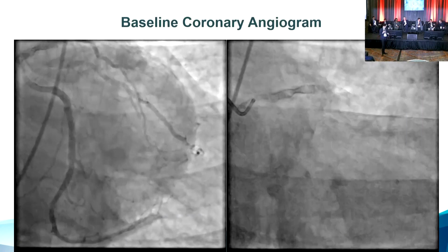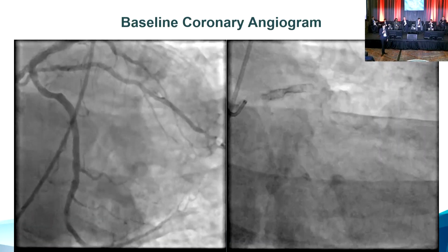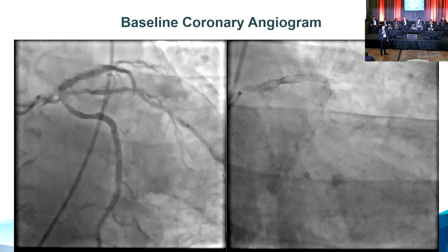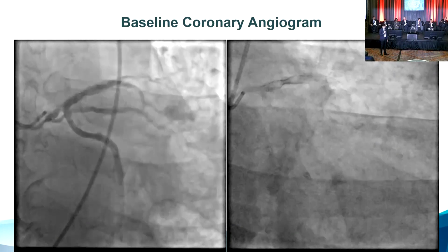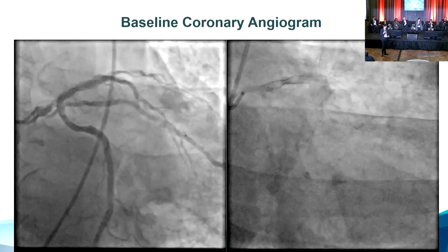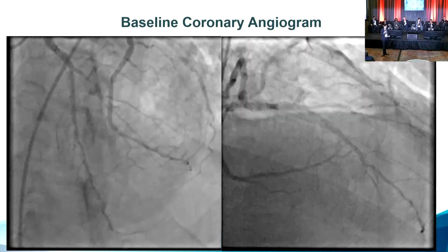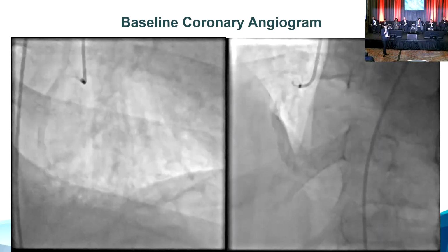You can see that he has severe left main disease and distal left main disease, possibly extending into the proximal LAD, and most remarkably, there is a stent in the LAD that is severely underexpanded. It was placed 2 years ago, and the patient surprisingly did not have an event with that. So these are other projections. It shows LAD stent underexpansion and severe left main disease.